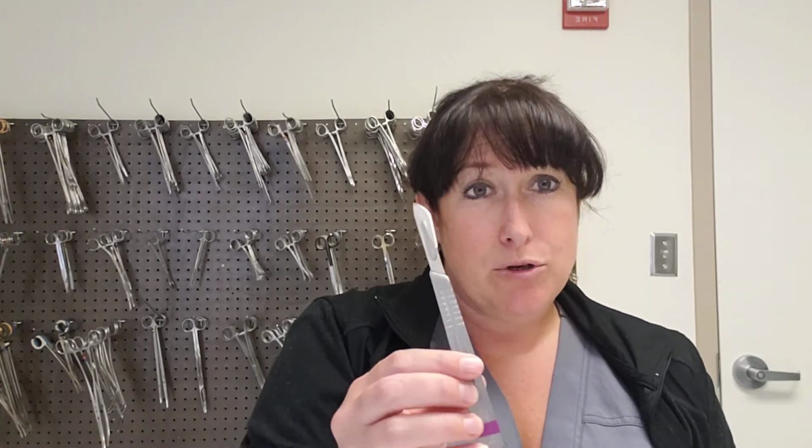Blade. Why would you use this? Why do you need a bigger one compared to this 10 that I already talked about, right? Well, that incision that goes from that laparotomy incision, it's a very large incision. It's better to use a large blade. The 10 or the 20 are appropriate for that incision, but not a lot. It really just depends on where you are. But currently in the clinical area where you guys are going to be, they're going to be using this 20 blade a lot more, especially for your laparotomy incisions, and then they like to use it for some orthopedic incisions, such as total knee and total hip replacements.